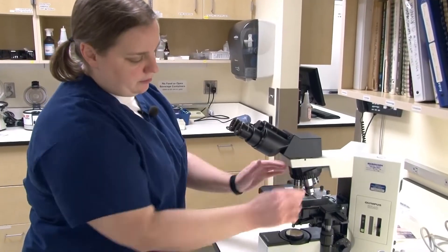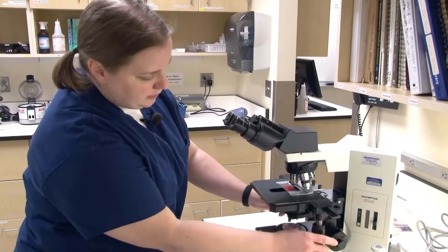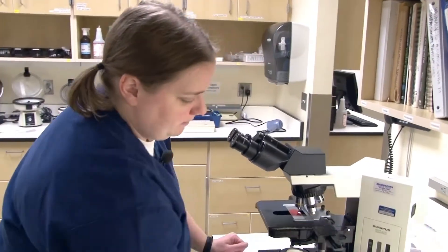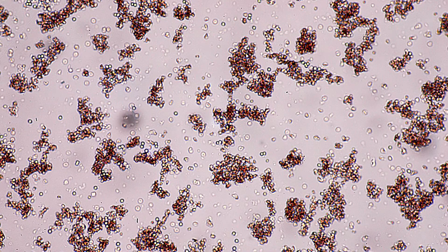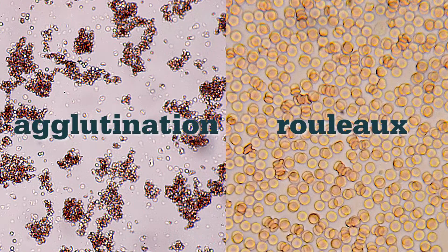I'm going to look at this under 10 power. I like to find a spot towards the edge of the slide where you have a monolayer of cells. What you're looking for is cells clumped together like grapes. Rouleau is going to look like cells stacked on top of each other, like coins stacked up, while autoagglutination is going to look like clusters of grapes — unorganized, just bunches of cells together. In this case, I definitely see autoagglutination.